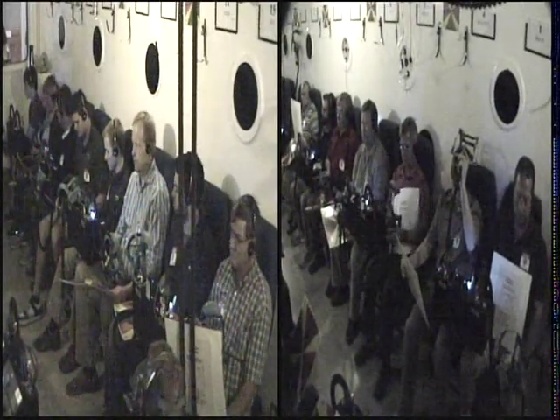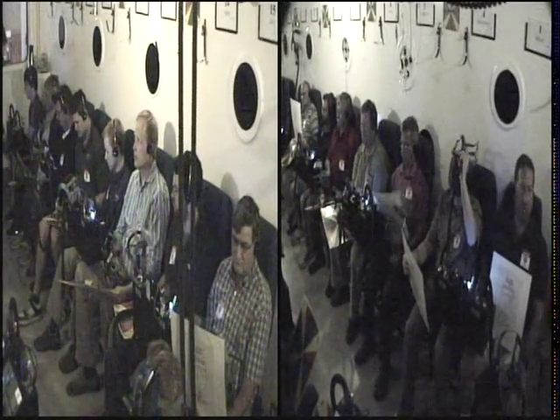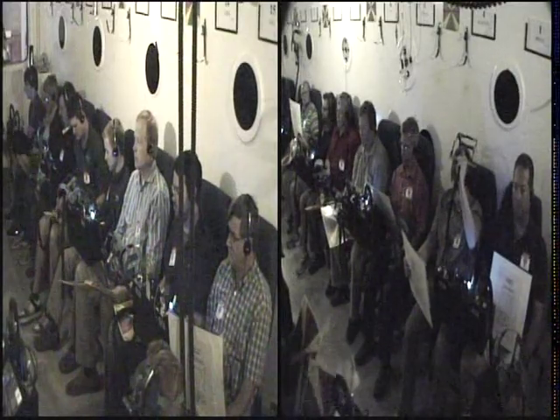And remember, take 3, I want you to actually hold your breath until you're focused on the card. And once you're focused on the card, take 3 good deep breaths of oxygen. So if you would at this point, go ahead and put the mask on, hold your breath, focus on the card. 3 good deep breaths of oxygen while focused on the card.